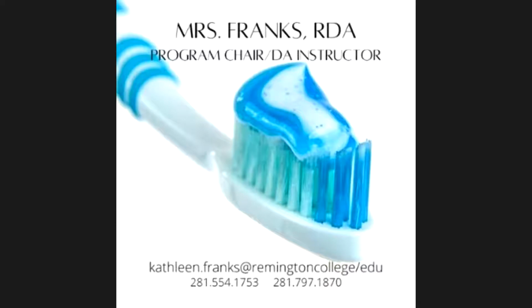What I find is really important when you take X-rays, probably one of the most important things, is looking at what you're doing. When I go to the dentist, too many times they'll just shove it in my mouth, and then they won't get a good X-ray, or they'll hurt me. It's because they get so lackadaisical about it. You have to look at where you're placing your X-ray. Everybody's mouth isn't the same.